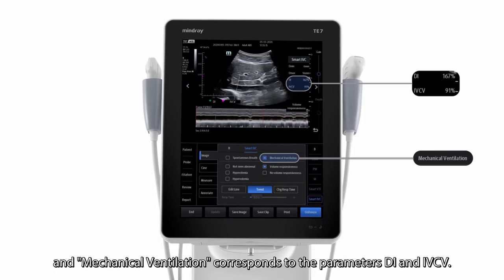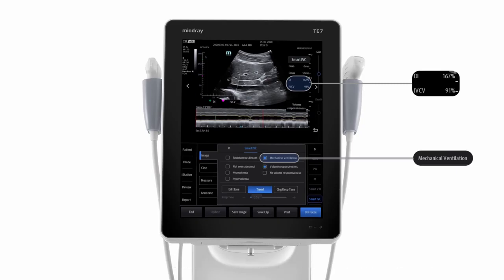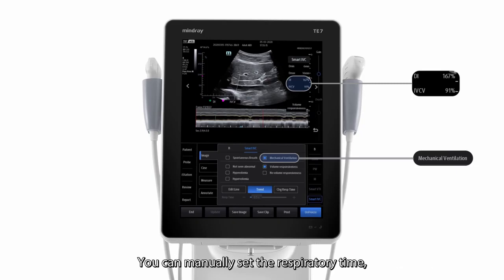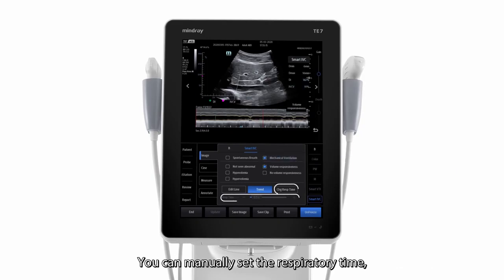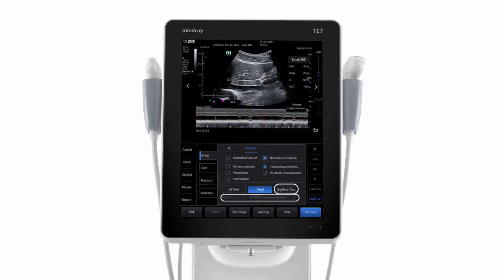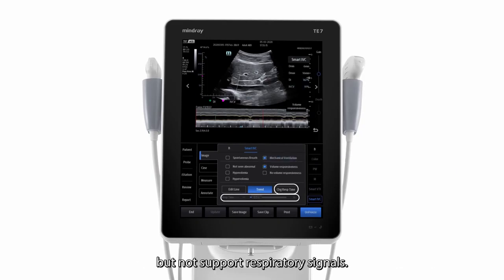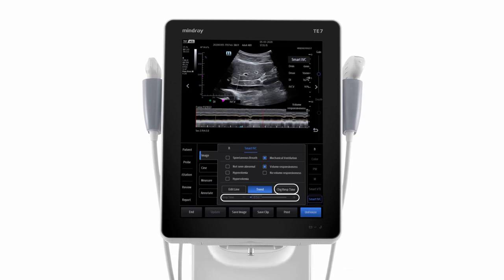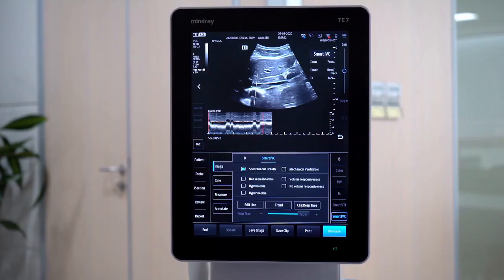Mechanical ventilation corresponds to the parameters DI and IVCV. You can manually set the respiratory time, but respiratory signals are not supported.